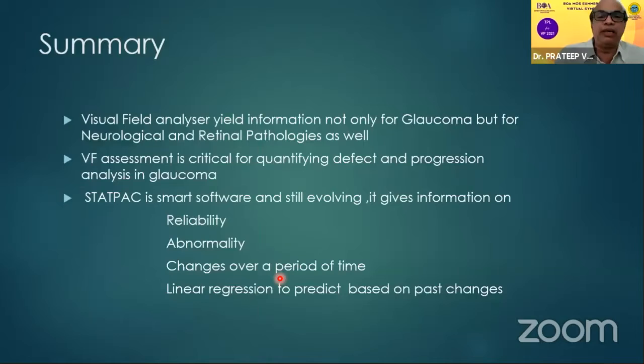and here it's a quadrant anopia. So in summary, the visual field analysis gives lots of information to us, not only related to glaucoma, but related to the retina and neurological defects as well. And it does a very good progression analysis. The VFI has added to our armamentarium for the good assessment of the progression of glaucoma and the prediction of what the patient will do 3 years or 5 years from now.